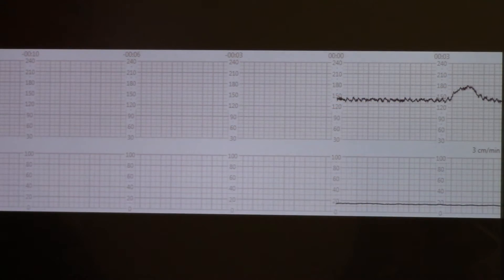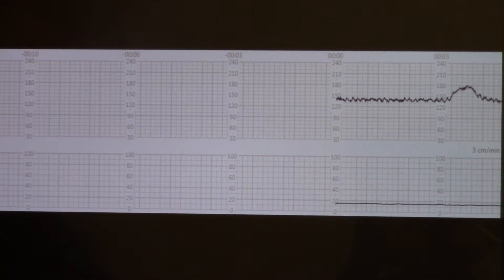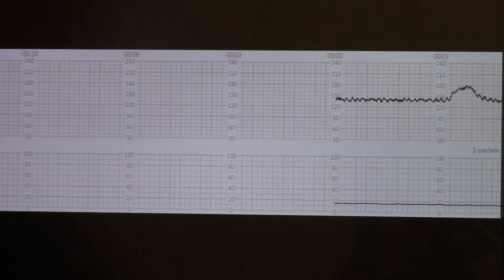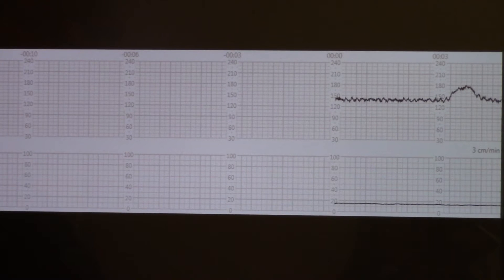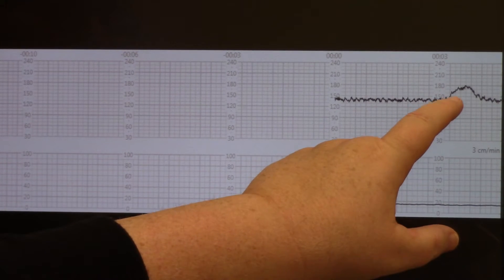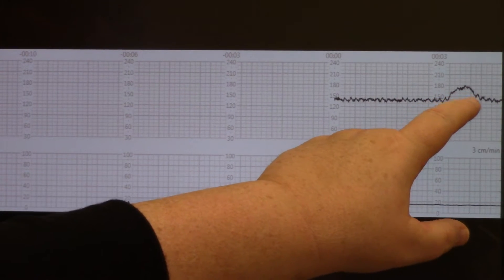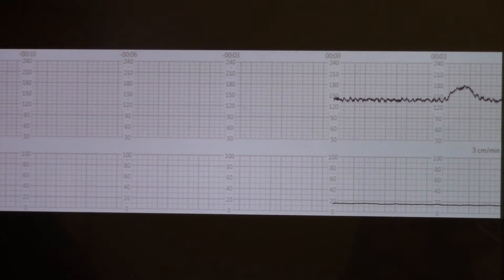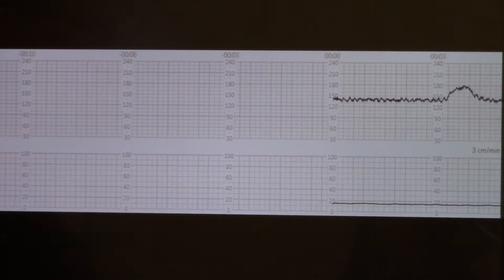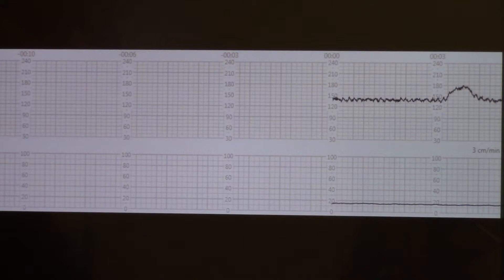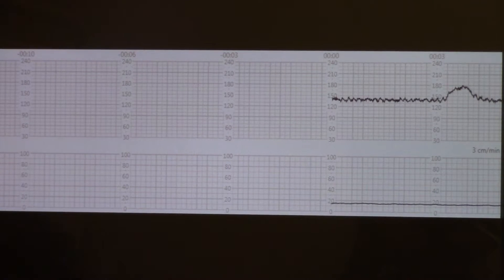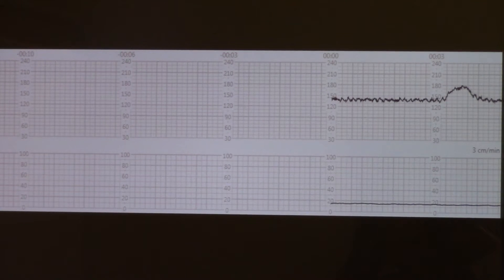It went from 140 up to actually 180, and it lasted for 10, 20, 30, 40, 50, 60 seconds. So that was a really good acceleration. So let's see if we get one more.